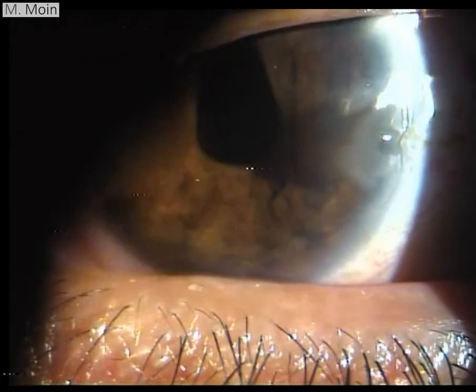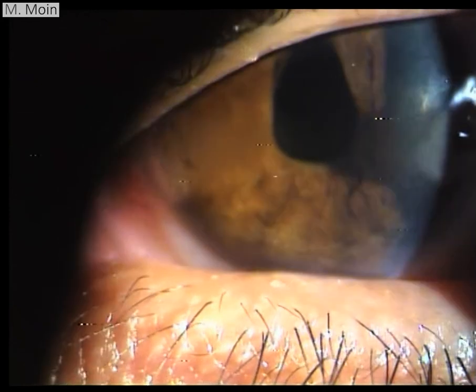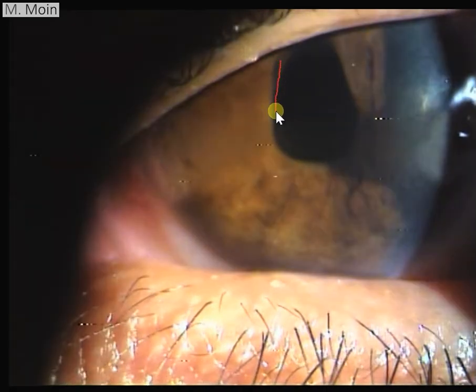So it's important to compare with the other eye in both patients. The other thing which you're seeing is this is an area of oval pupil. Yes, we have band keratopathy which is present over here. You see these clear areas. This is the area where the nerves are going through the cornea in the Bowman's membrane. That is why you see that area.